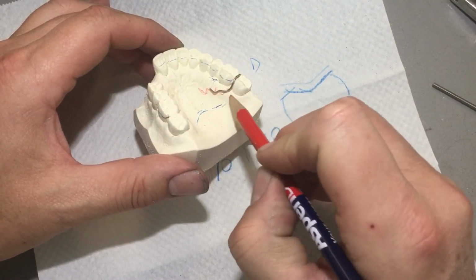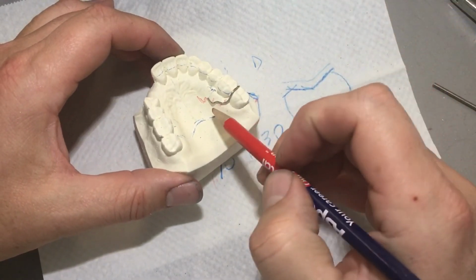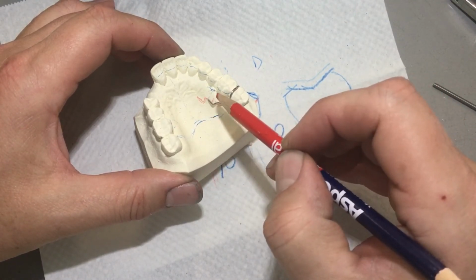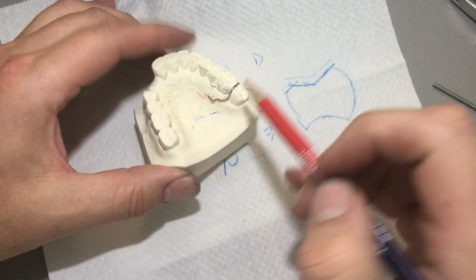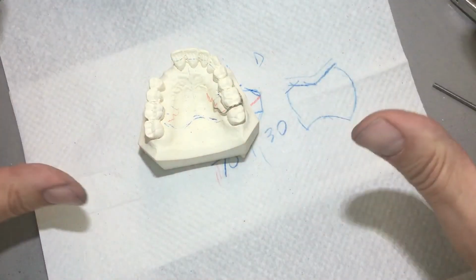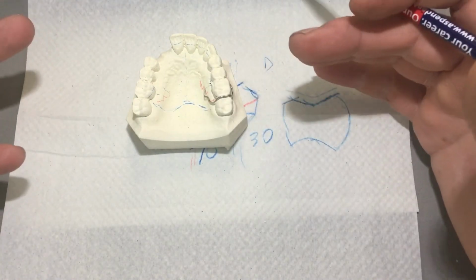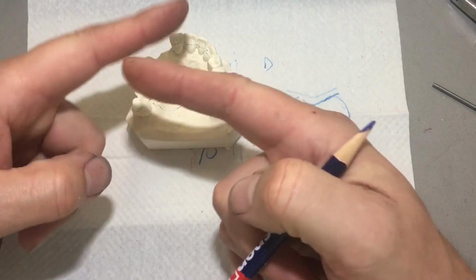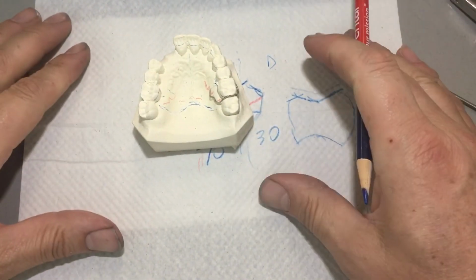Now, this kind of zigzag is just all retentive to stay in the acrylic. You could do more, you could do less. You could do a circle, but then I think that looks more orthodontic to me if you do the loop. Just a couple of zigzags, but whatever you do on this side, do the same on this side so it looks symmetrical, so it looks like, as the dental technician, you had control of the wire. I don't want one coming up here and the other one going across the center, kind of like this with my fingers. Make them the same. I hope that makes sense.